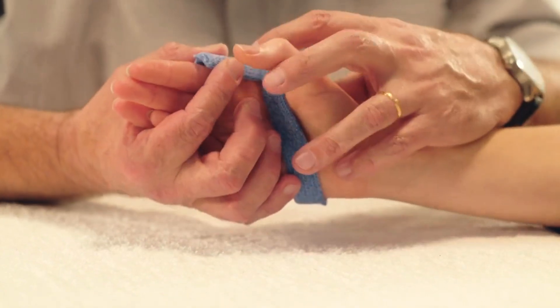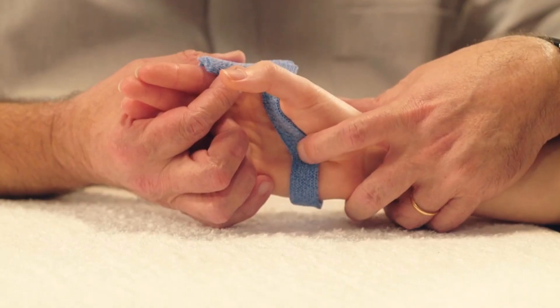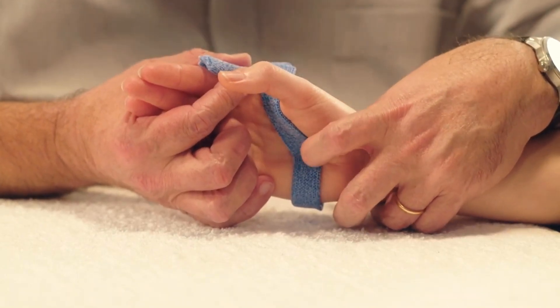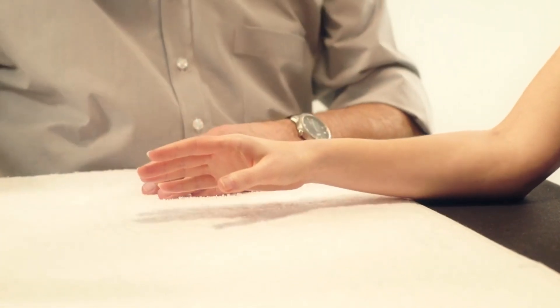Carefully hold the fingers in the right position. The hand arches are perfectly moulded while respecting the opposition of the thumb. Remove the first piece after hardening.